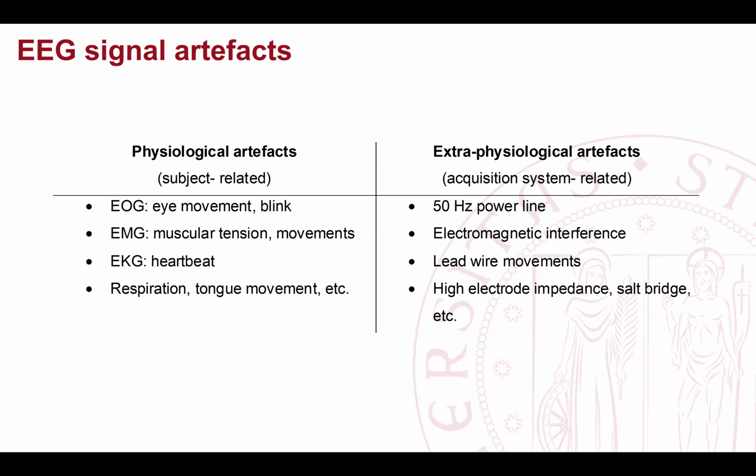Actually, not much in the EEG signal, fortunately. Mostly if you work with MEG, magnetoencephalography, you see the heartbeat very clearly, and also the apneas, of course. With the EEG, it is at least one of the noises that is not that problematic.